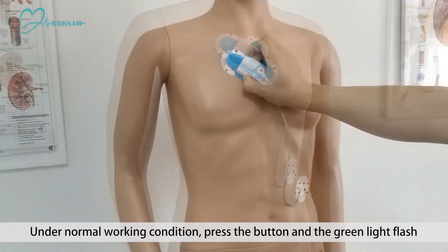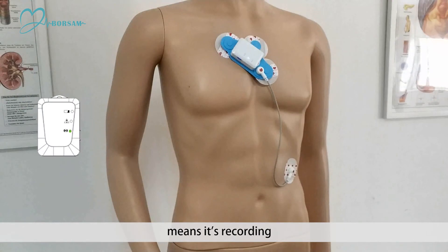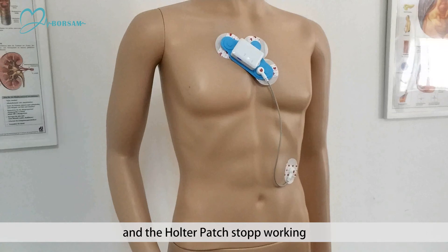ECG events mark: under normal working condition, press the button and the green light flashes, meaning it's recording. In case the light does not flash, the battery may have run out and the Holter patch has stopped working.